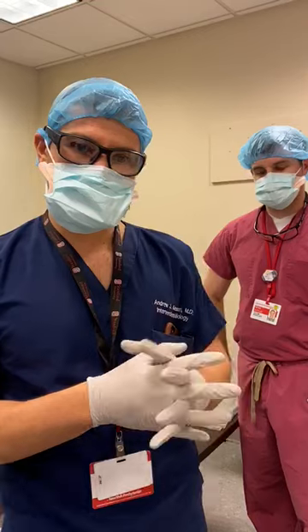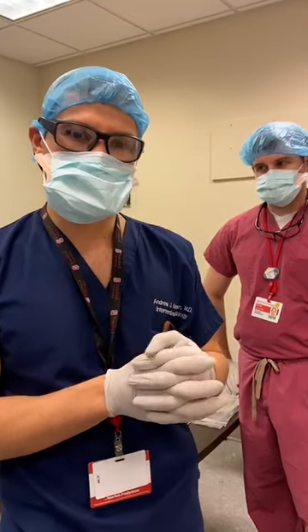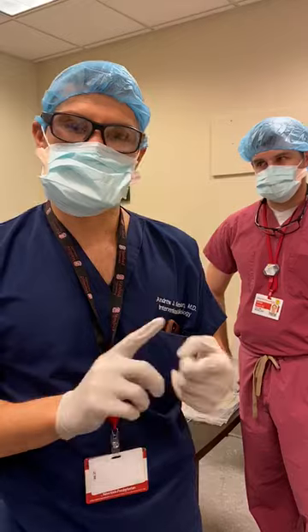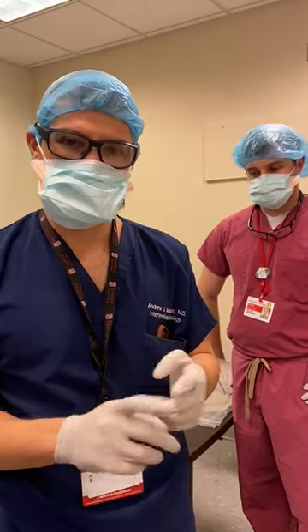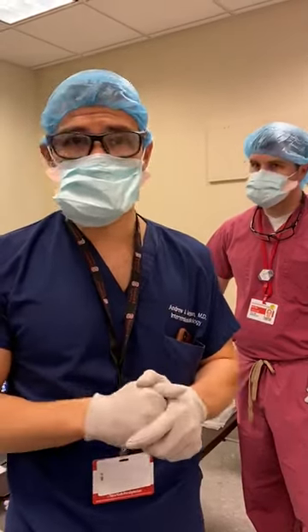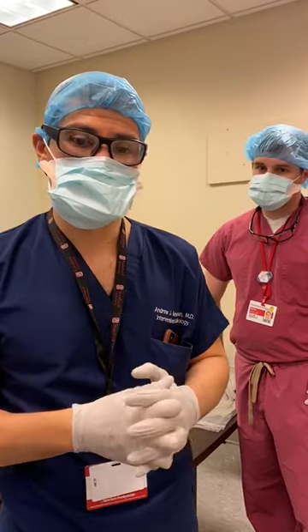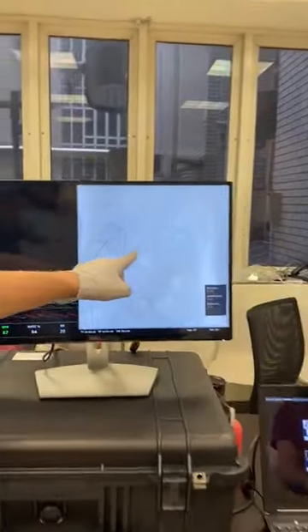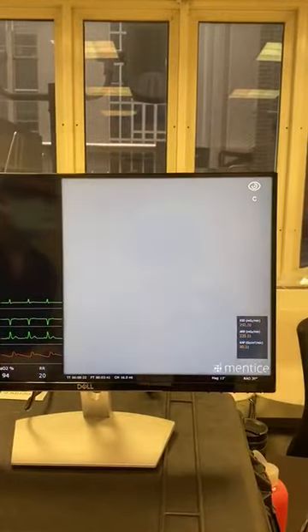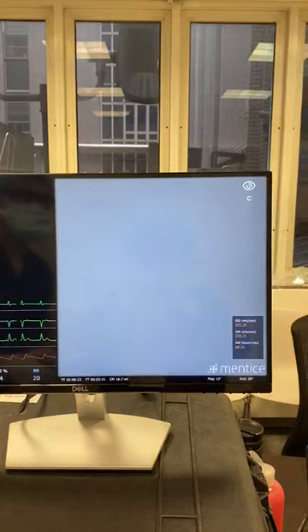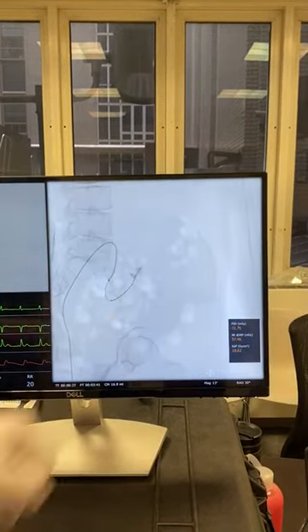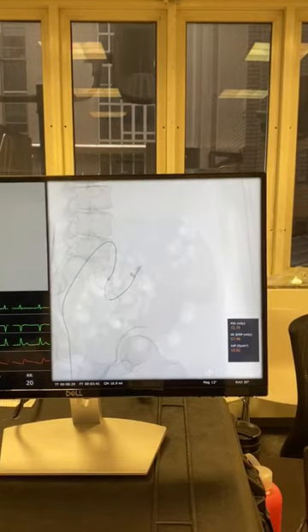For focal injury, or somewhere where you can deliver a coil more selectively, you're going to want to use one of two types of coils — either detachable or pushable. Here on the Mentice, we're going to demonstrate detachable coils, which are a little bit more precise. Dr. Smith has already demonstrated the active area of extravasation, and you can see the vessel that he's looking to coil across the area of extravasation.